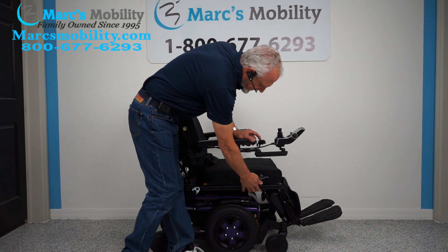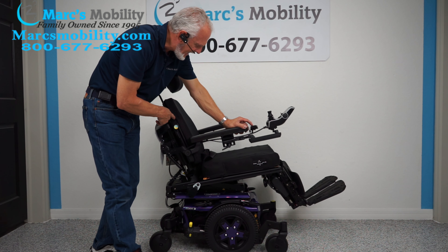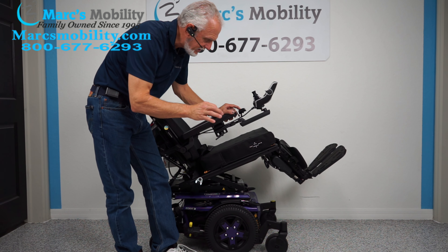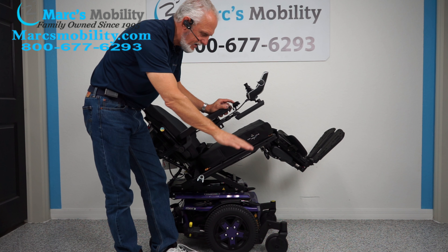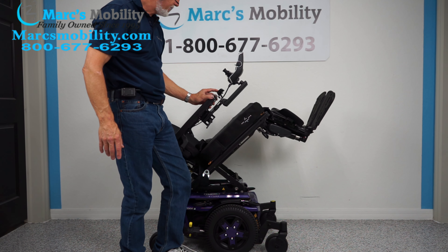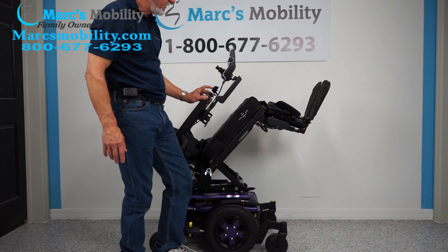The next feature I'm going to show is called the electric tilt. The electric tilt is when the base goes back, taking the legs and the back with it. One thing about these buttons: there's a one-second delay, so if you push the button and it doesn't go back, just hold on — it's a one-second delay. This is your electric tilt.